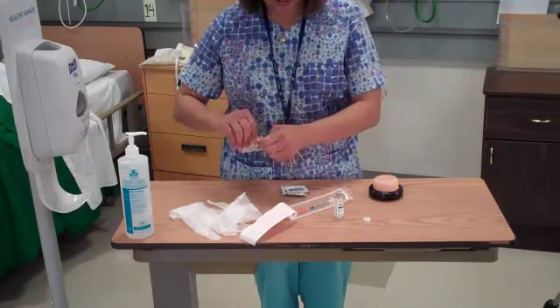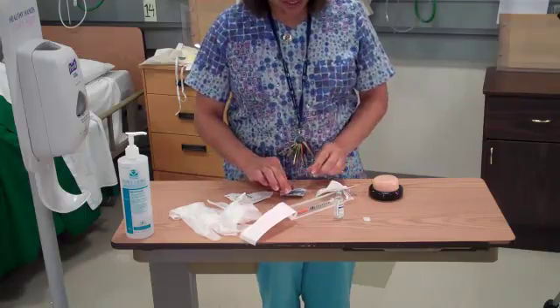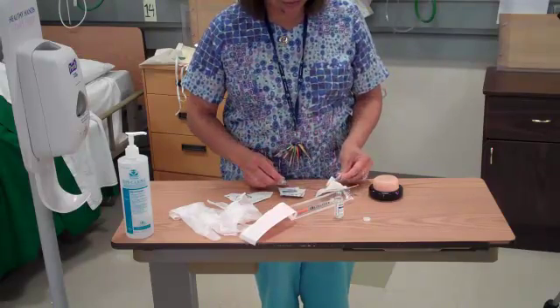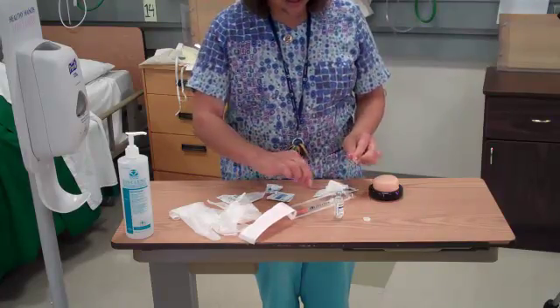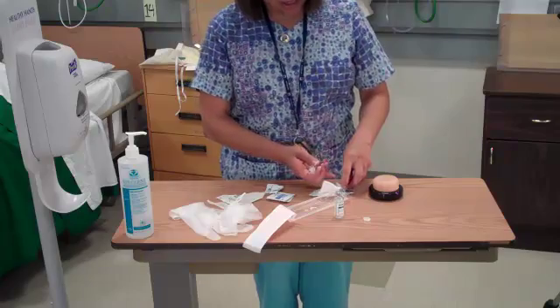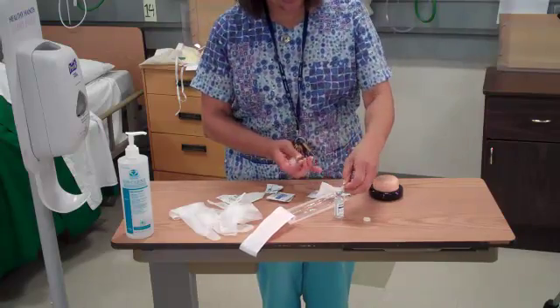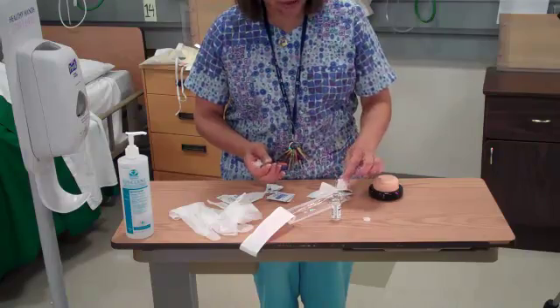I get my equipment ready by opening up my 2x2 and a couple of alcohol wipes. I'll go ahead and take my insulin syringe, take one of the alcohol wipes, wash off the rubber stopper, and clean off the rubber stopper.